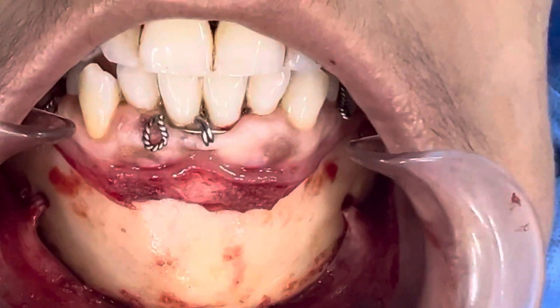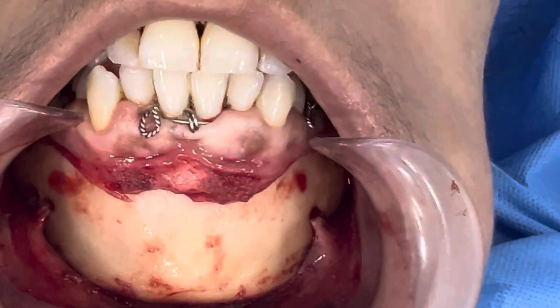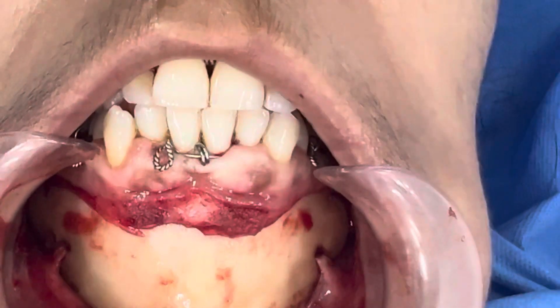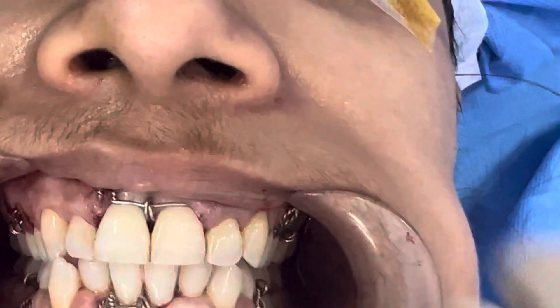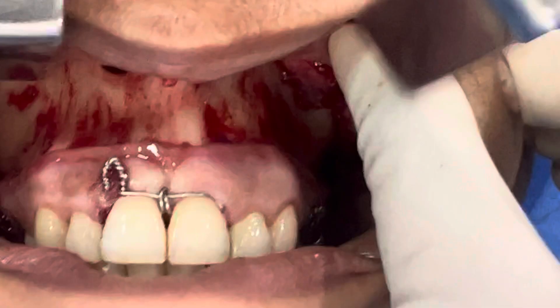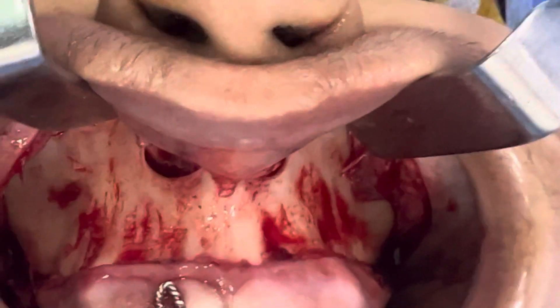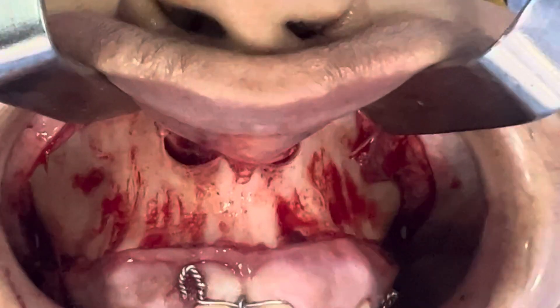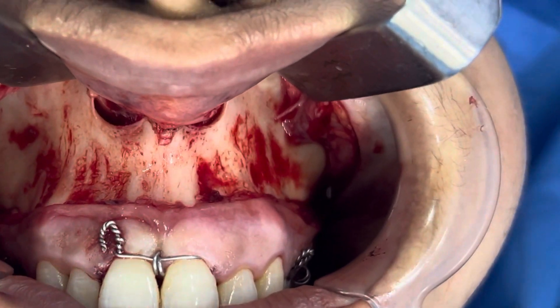We've exposed the chin and we're planning to do an augmentation genioplasty. We're also going to do an upper jaw surgery. We've exposed the upper jaw and we're going to be impacting it to reduce the excess there is right now.